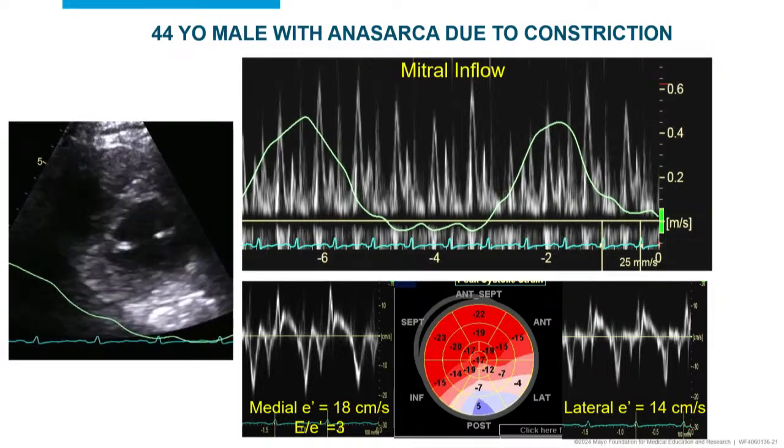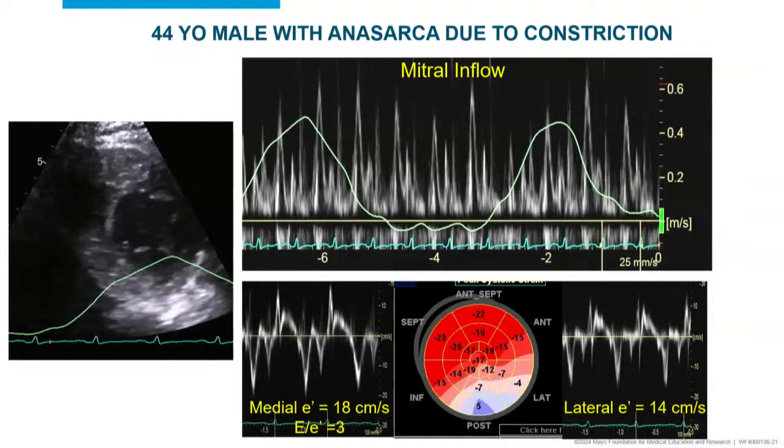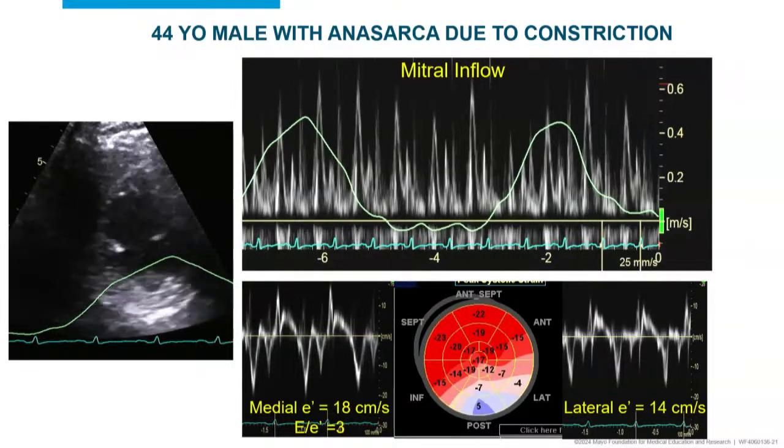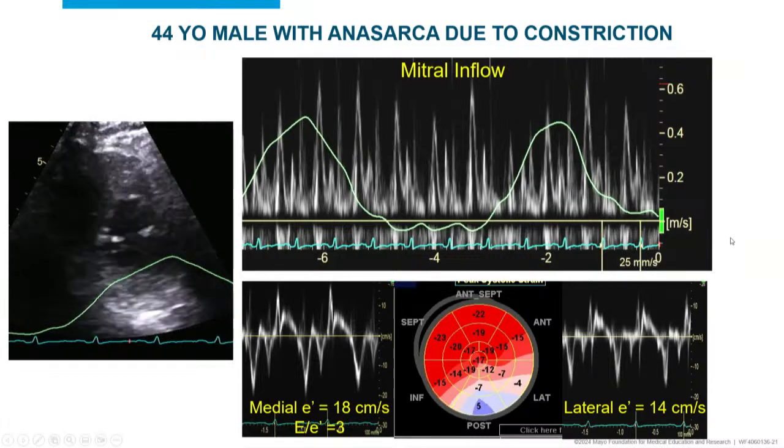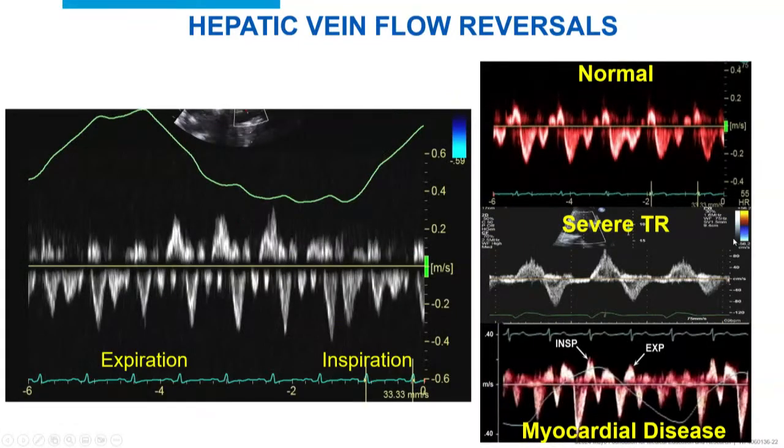So now we are using echocardiography as a first-line diagnostic hemodynamic method, and most of the time it can be quite conclusive. More specifically, this patient has hepatic vein Doppler showing lower forward flow velocity with expiration and a significant flow reversal back into the hepatic vein, resulting in ascites, right? And I think it's so important for the members of echocardiography, our sonographer staff, and fellows to look at hepatic vein Doppler, which has been so important.